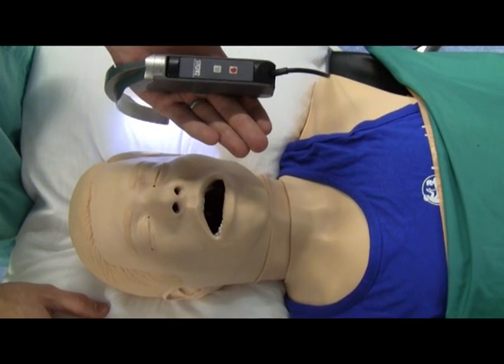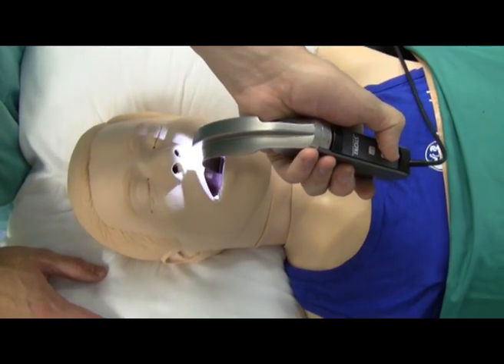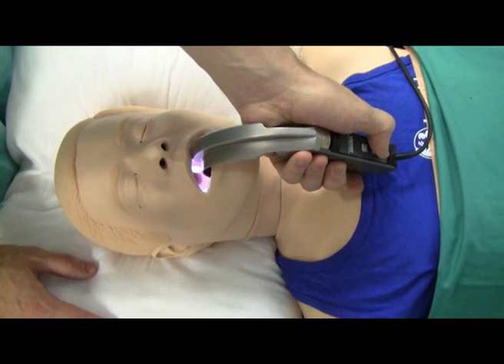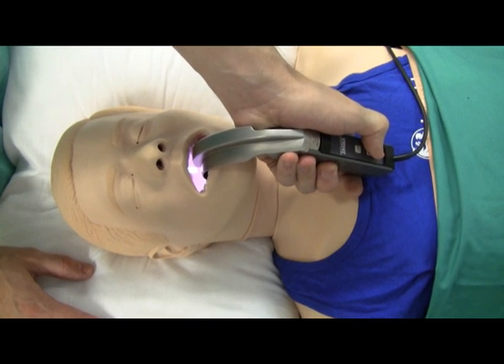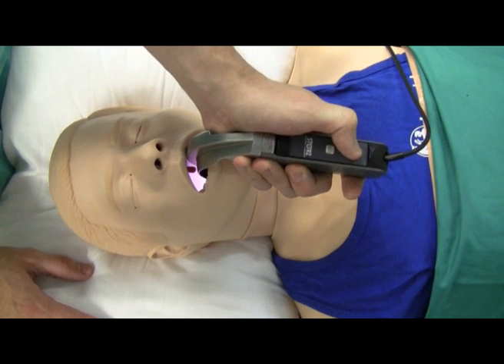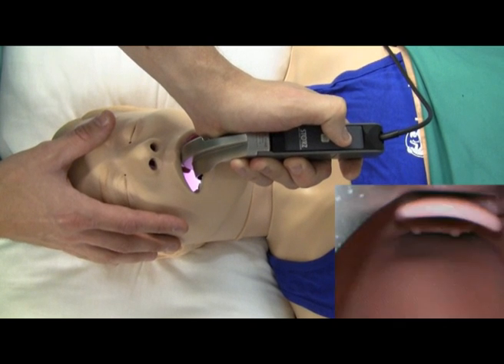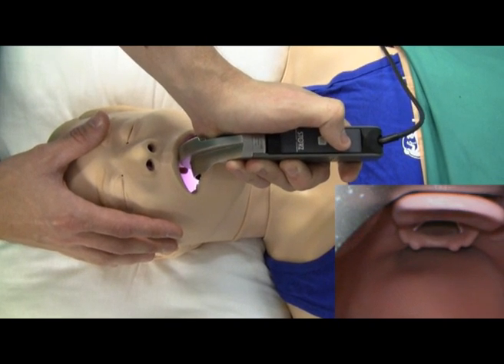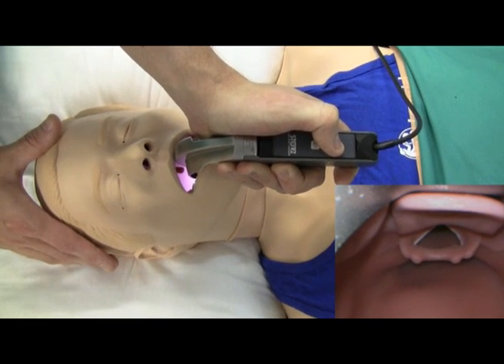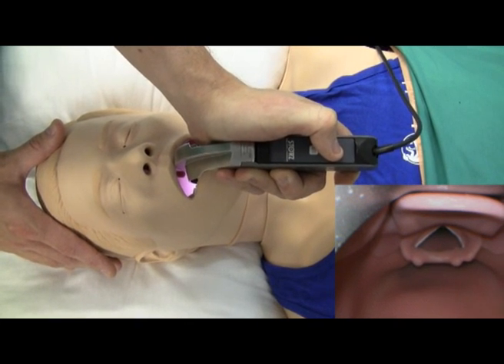The C-Mac laryngoscope is designed to be held in your left hand, similar to the Macintosh. Insert the C-Mac into the mannequin's mouth in the midline, being careful not to strike teeth and lips. Looking into the mouth, advance the blade of the C-Mac laryngoscope. When it's about halfway in, look at your screen. On there you'll see the epiglottis at the top and below that you'll see the glottis. The vocal cords are the two structures with the white lines.